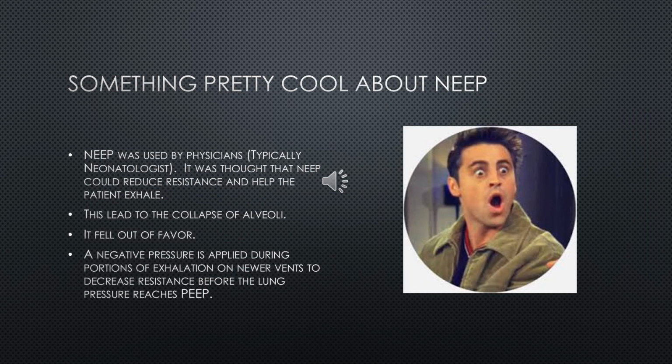Like I was saying in the last slide, NEEP was used by physicians, typically neonatologists, and it was thought that NEEP could reduce resistance and help the patient exhale better, which kind of makes sense, but that led to alveolar collapse. So it fell out of favor, and now we use positive end expiratory pressure to shunt open the alveoli.